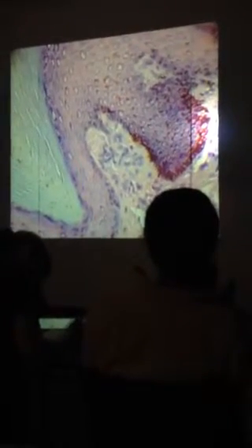Now, here's a fan favorite. What's that thing? How many people drew a Meissner's corpuscle? Lots of you did, right? Did you draw a little squiggly thing in a dermal papilla, right? And this is also from pigmented skin. You see the pigmented cells right here? Okay. Pigmented cells are usually in the stratum basale and possibly in the stratum spinosum. You can see some of these cells are pigmented. Okay, this is the dermal papilla coming up like this. So this is all dermis in here.